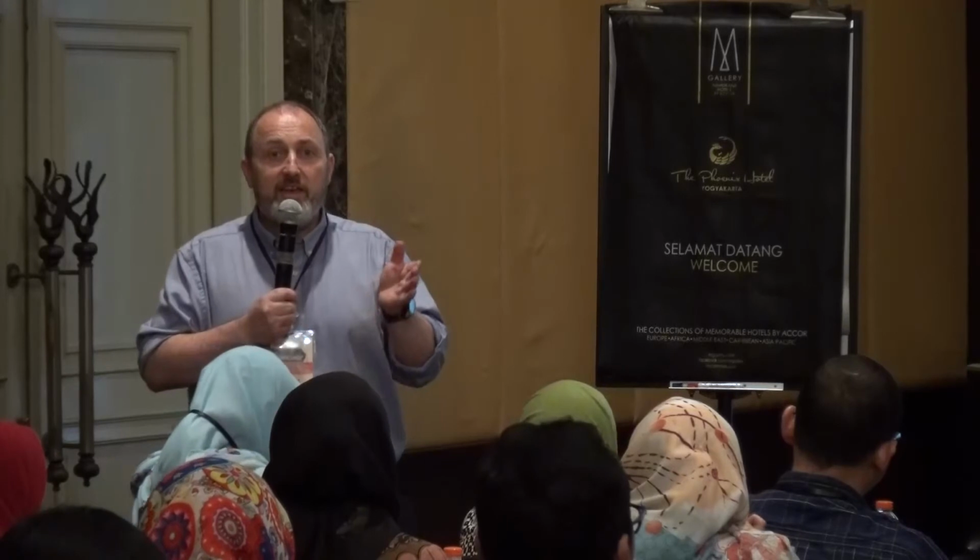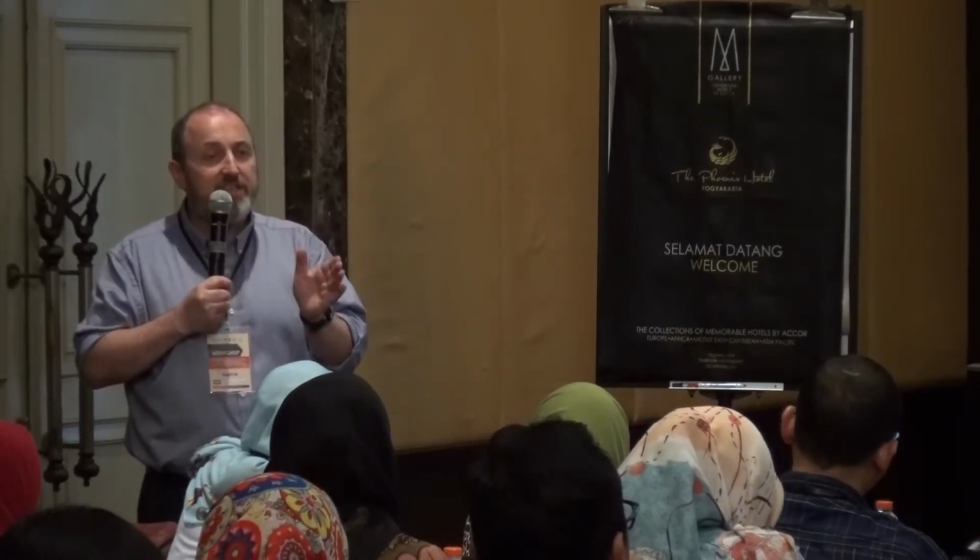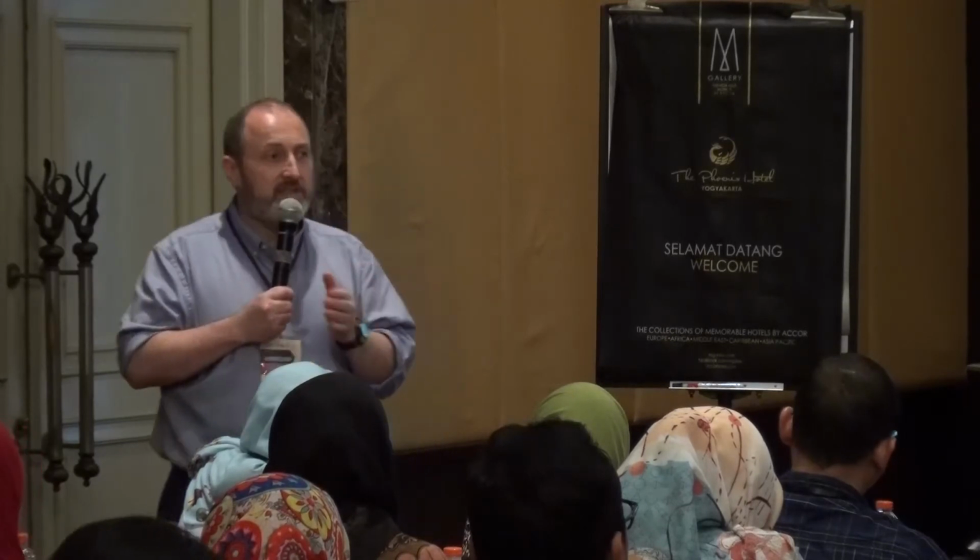So it might be, for example, it certainly will be an assessment of progress in labor, both abdominally and vaginally. And that information will be used to inform whether you can perform an instrumental vaginal birth or whether you feel you have the time to wait until you can perform an instrumental vaginal birth or a spontaneous delivery, or do you need to bail out and do cesarean section, for example. So in terms of decision making, non-reassuring should require a conservative approach, but something should be done. Pathological requires a concrete decision as to whether delivery is warranted or not.